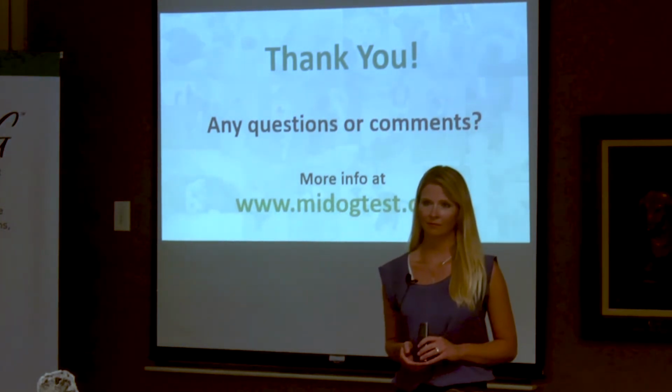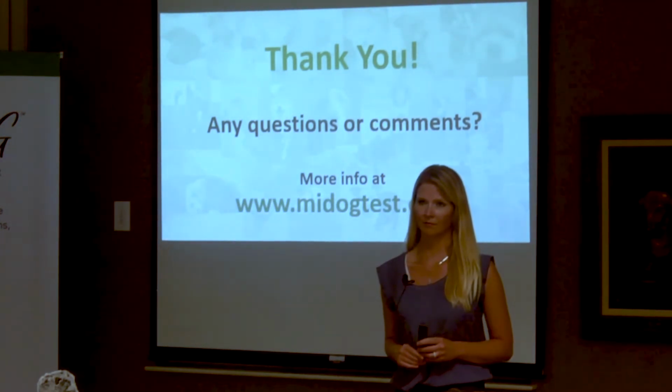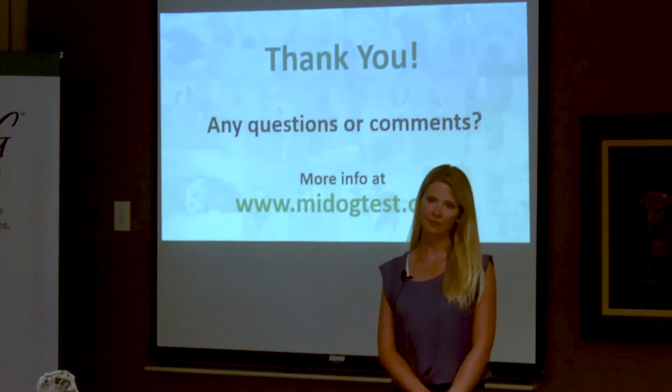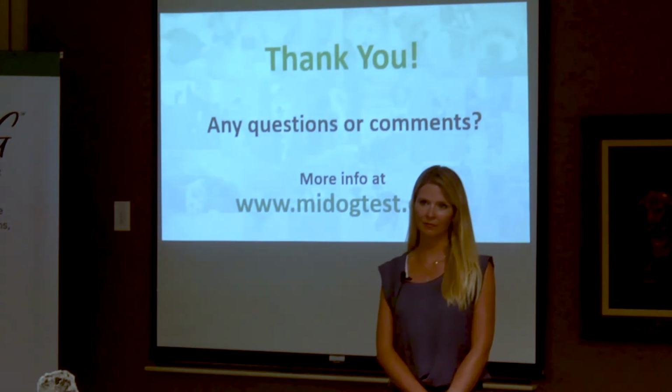Otherwise, anaerobes exposed to oxygen cannot survive. When you have anaerobes, that means there's a biofilm or something else protecting them, or actually earwax, which indicates those are severe cases. We are very excited about that, and we are thinking about publishing all the data.